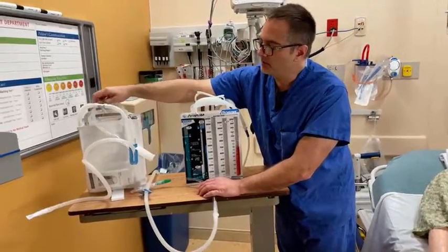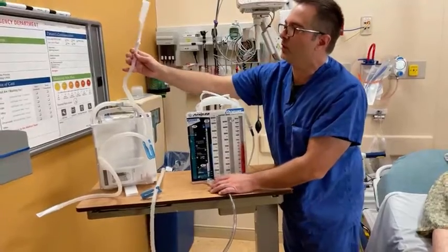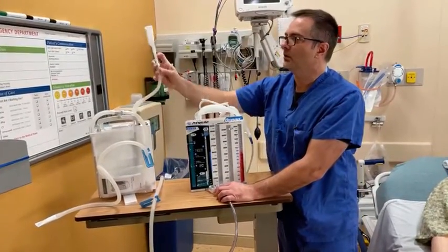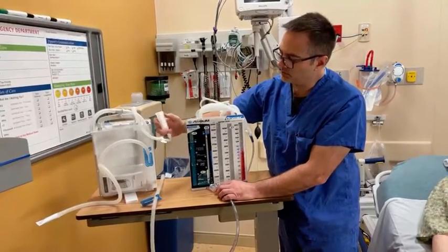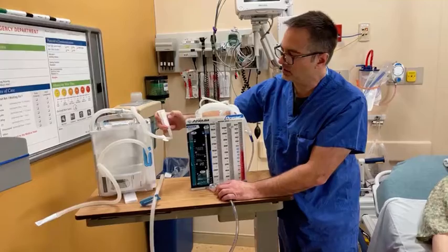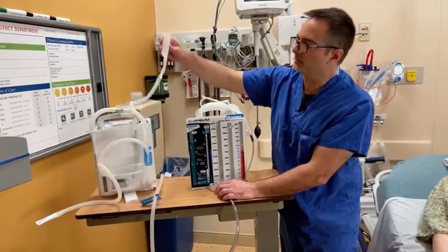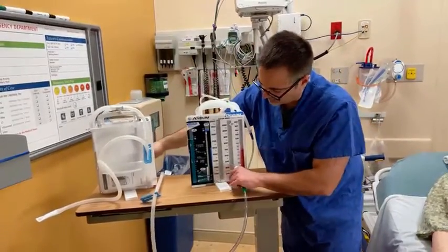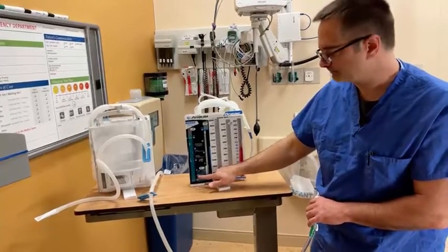Also, on the back here, the second tube is the tube for filling the water seal chamber. In this particular model, it comes with a funnel. When I fill this funnel, I'll lower this down to kink the tubing. While difficult to see on the video, there's a little hash mark here that indicates how much to fill it up to. Once I fill this up, I'll raise it up and it will dump the fluid into my water seal chamber. And like on this one, it'll fill it exactly to the 2 centimeter mark.